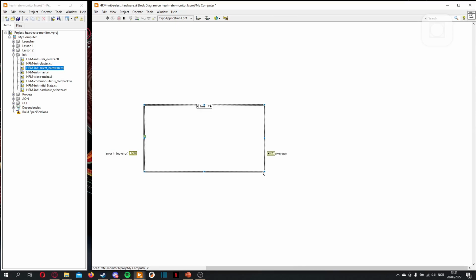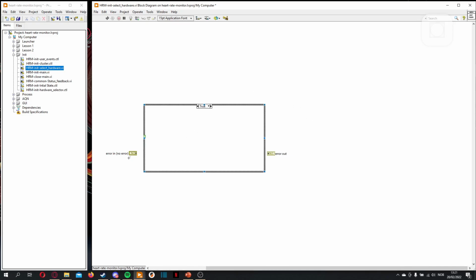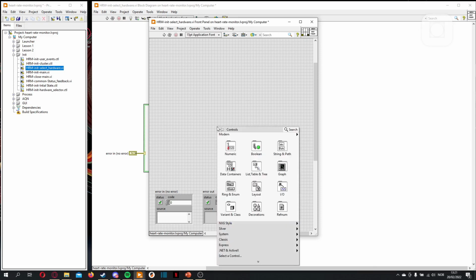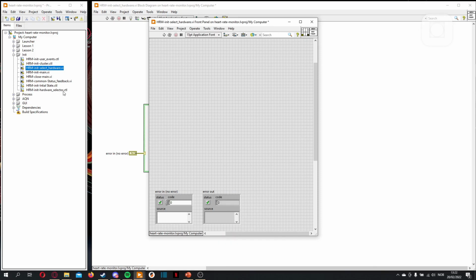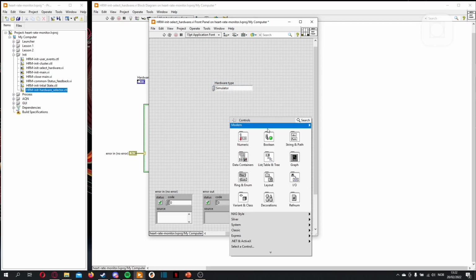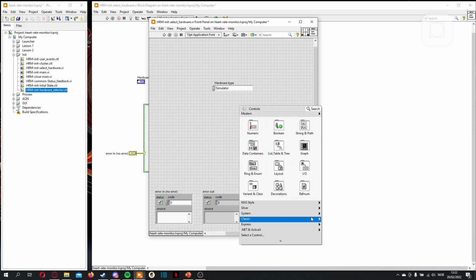So what we do want is to make a pop-up. We want this whole screen to be a pop-up. If there's no error, we would like you to be able to select between hardware or just cancel. So you can start by just dragging this one in, because that's what you want to select. You want to select the type of hardware you want. But we should also have an OK and cancel.